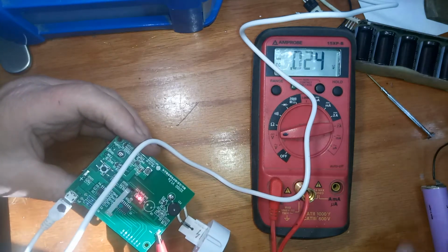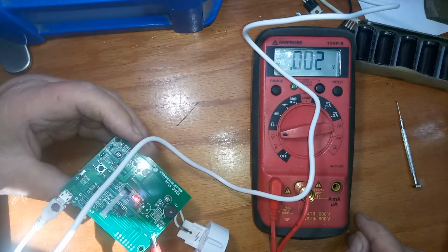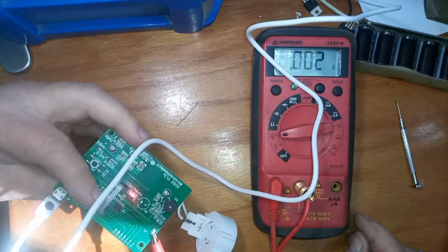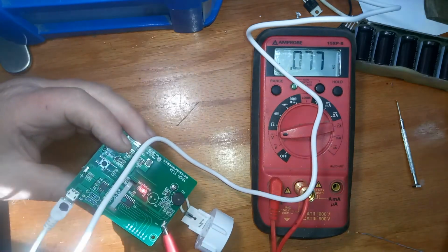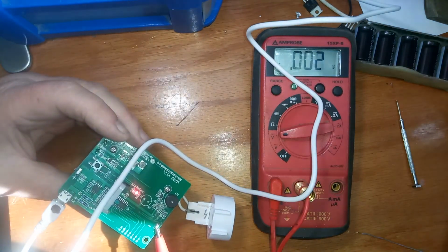And we got 0 volts there. If you leave a lithium battery at 0 volts for a week, it's going to be no good anyway. So there's something really bad here. The IC is heating up. It looks like I'm a loser. Wah, wah, wah. Okay, that's it.